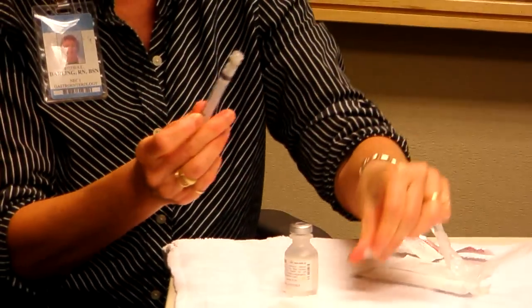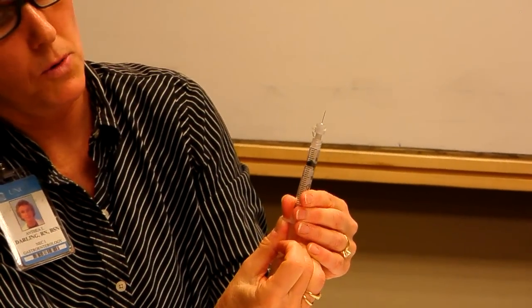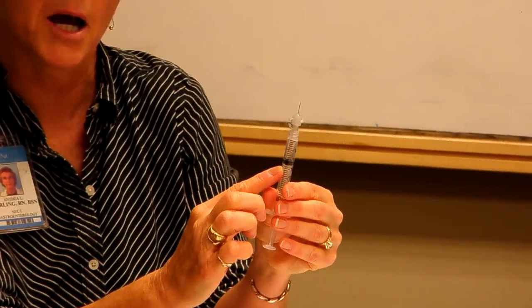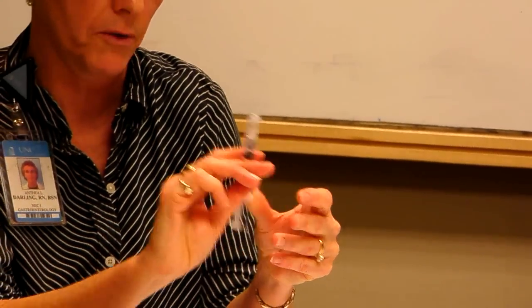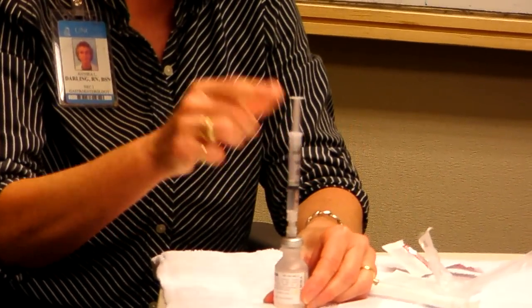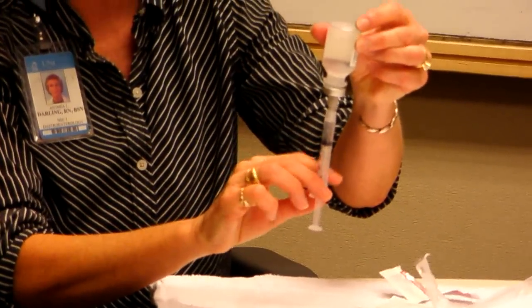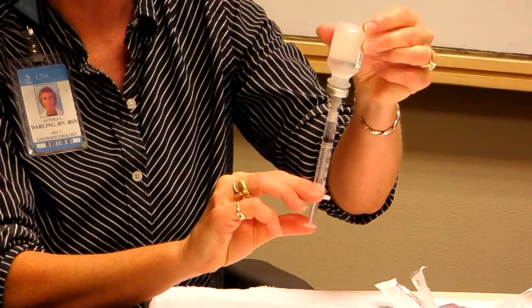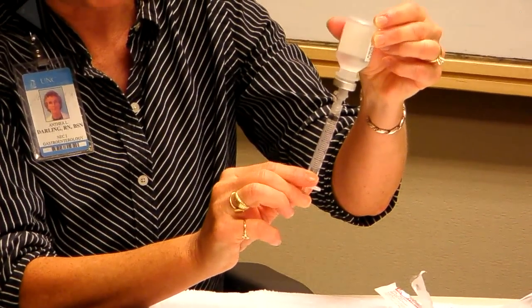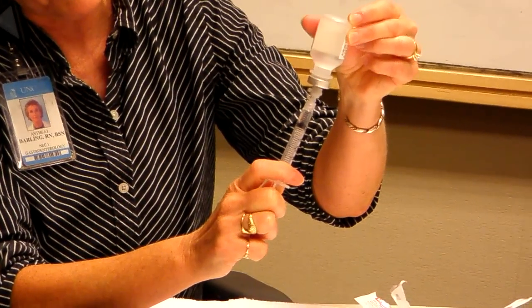You take your needle, syringe. I'm going to draw back to the 1 milliliter portion of the syringe. This is the amount of the volume that I'm going to be self-administering. The reason you do that is to prevent a vacuum from occurring in the vial. Put the needle through the rubber stopper, turn the vial upside down, and you push that air right up into the vial. And then you slowly draw back to the amount of medication that your doctor has told you to give.